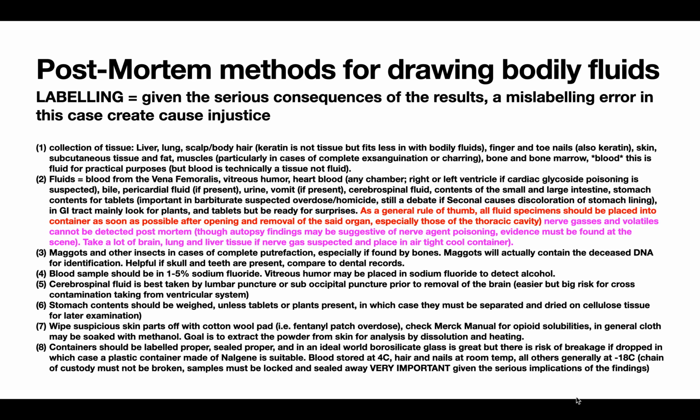You draw blood from the vena femoralis and you place it into sodium fluoride so the erythrocytes don't break down and release cellular contents.